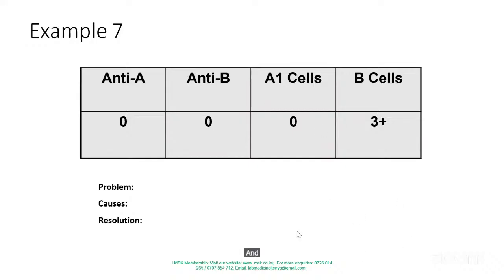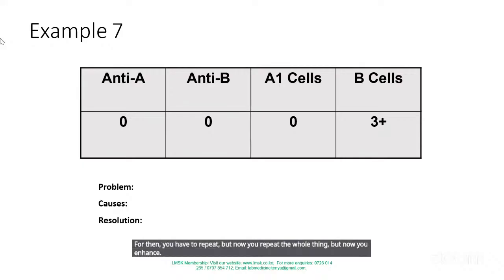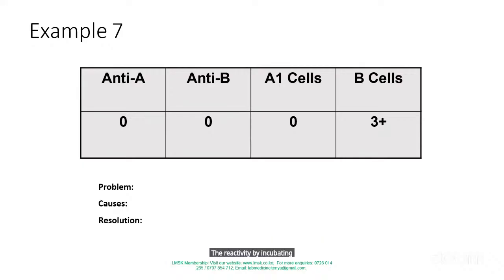And if that was done, then you will have to enhance the reactivity. You repeat the whole thing, but now you enhance the reactivity by incubating for 30 to 60 minutes at room temperature.